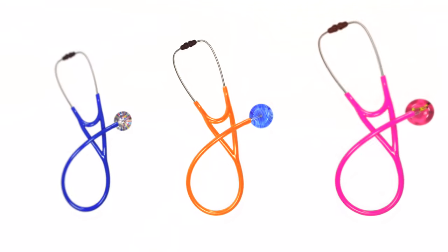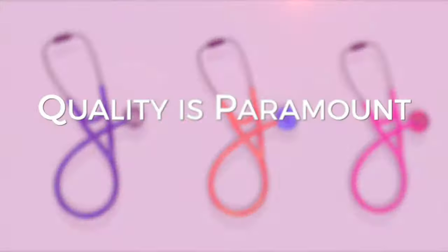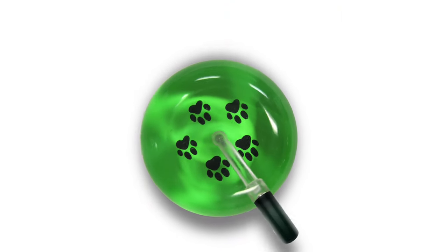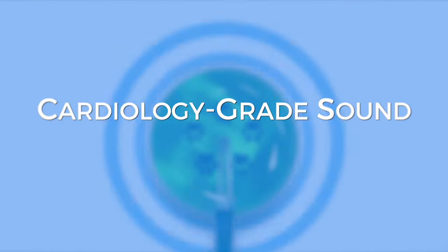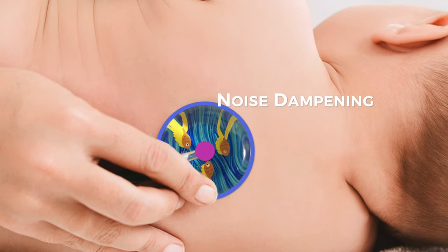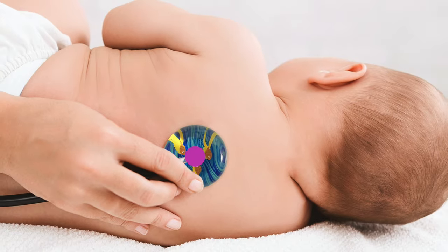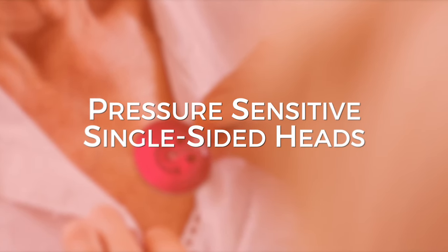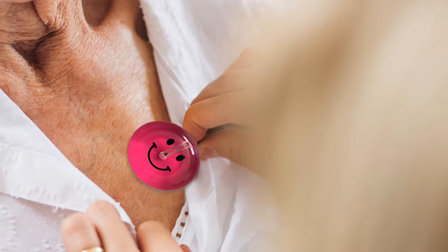Ultrascopes are not just about fashionable design, though. We know quality is paramount. That's why our acrylic stethoscope heads are designed to provide cardiology-grade sound. The noise-dampening capabilities ensure you hear the sounds you need to without interference. All Ultrascope stethoscopes have pressure-sensitive single-sided heads, so you can perform auscultation quickly and easily.